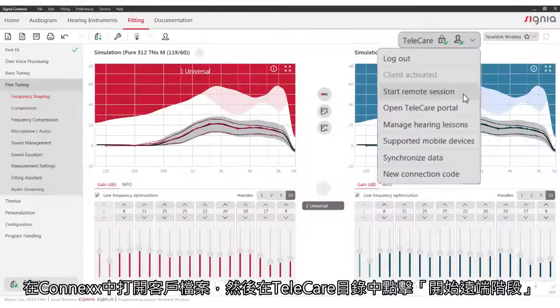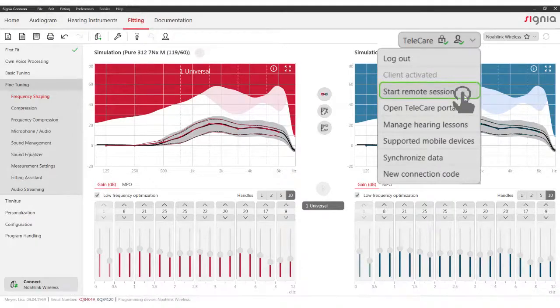Open the session of your client in Connex and click on Start remote session in the Telecare menu. Select the type of call that you would like to initiate.